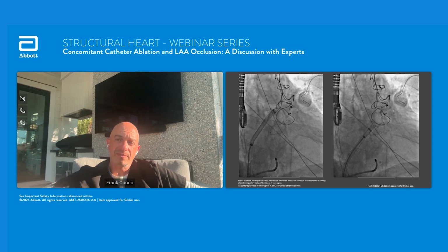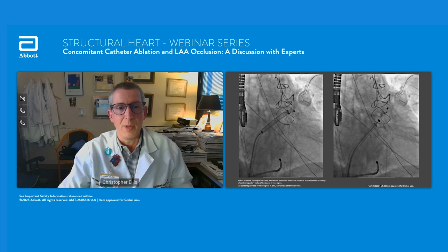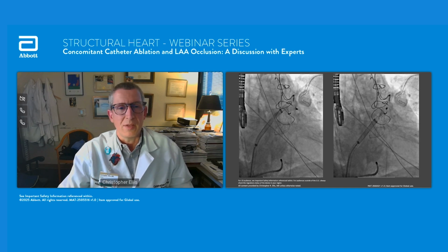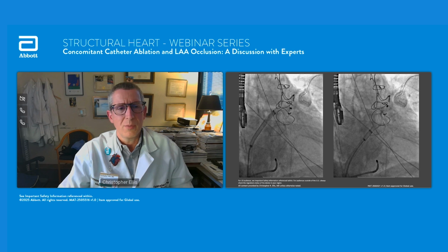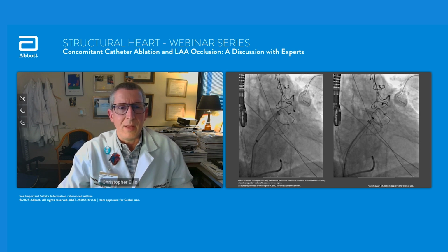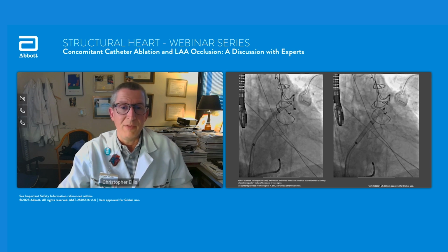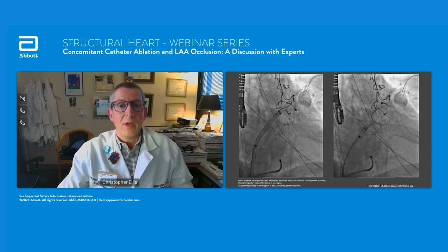Yeah, I try to optimize the transseptal a little bit more for the appendage than for the ablation, because I feel like there's some wiggle room. You don't have to be in the perfect spot for the ablation part, but it does make it a lot harder if you're in a bad spot for the appendage closure.